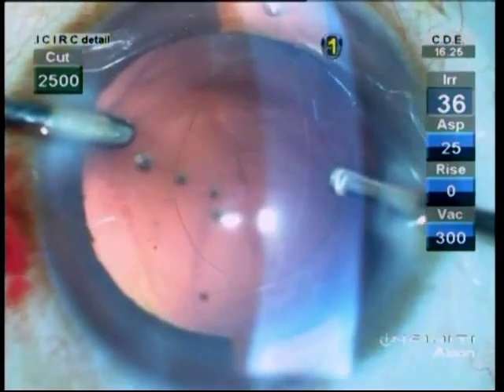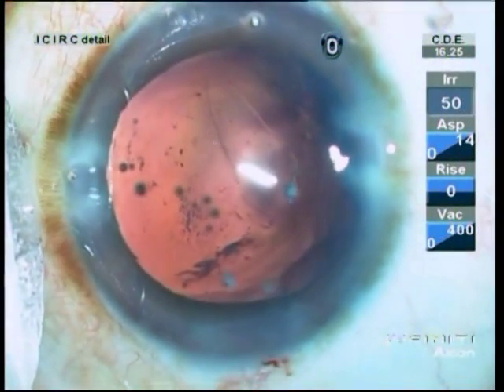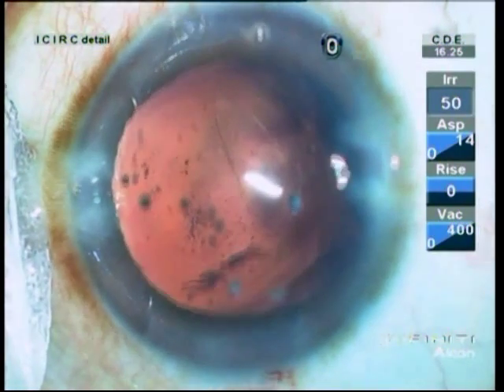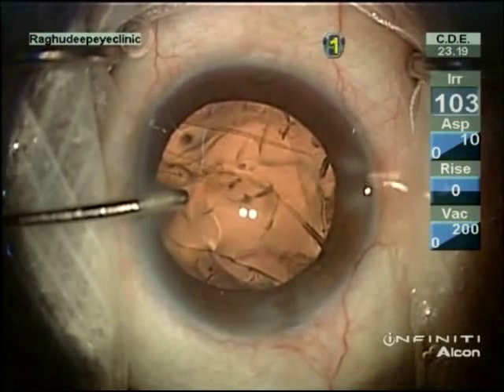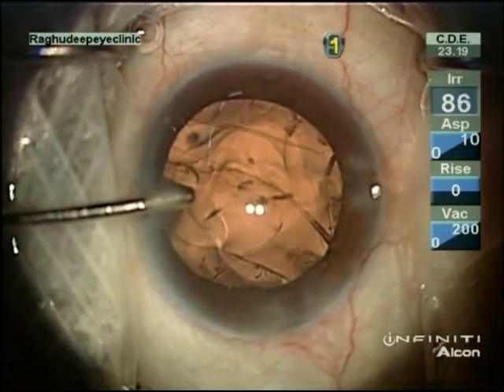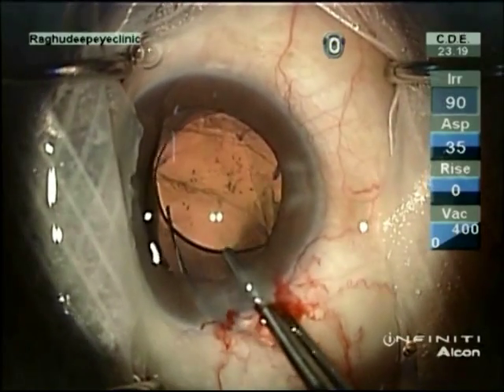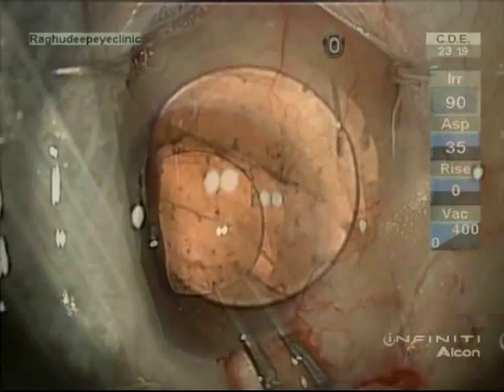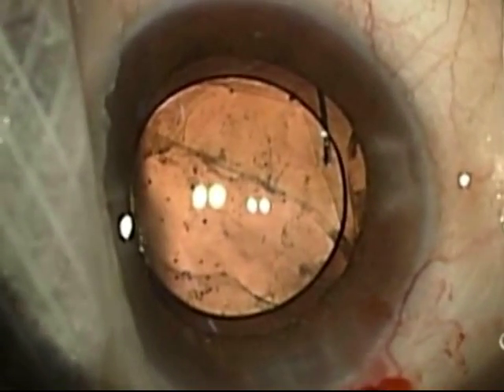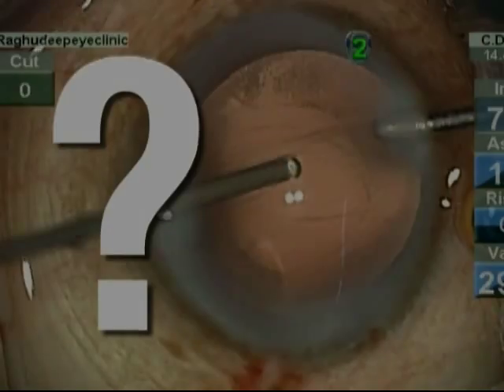But notice how the original tear has enlarged from what it was. More often than not, what begins as a small breach ends up being a huge rent. This results in insufficient posterior capsule support for in-the-bag IOL implantation. In these circumstances, sulcus fixation, though less desirable, has to become an acceptable option. But have you thought of why this tear blows out?